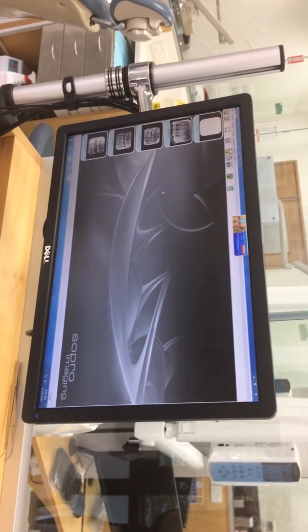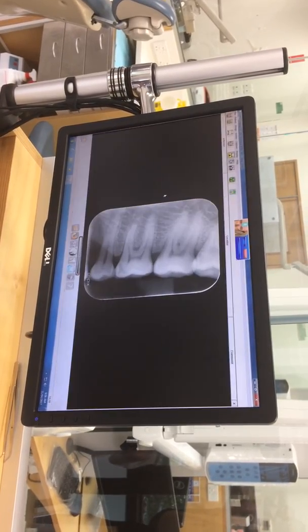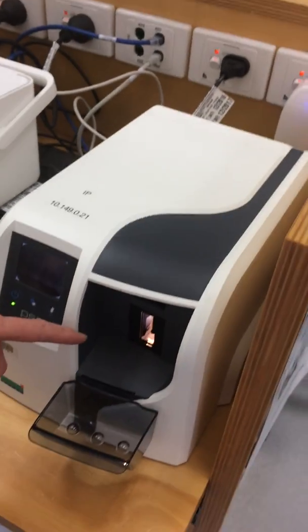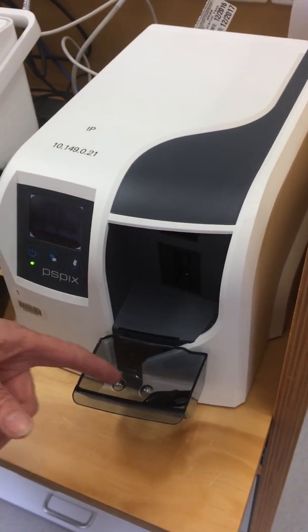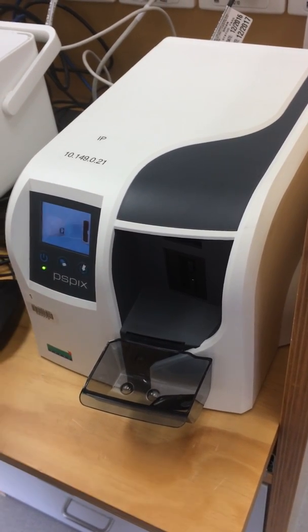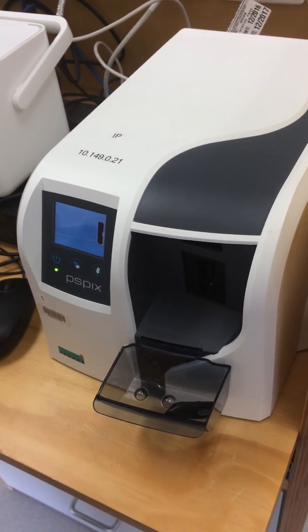Then wait for a short period of time — the image will be projected onto the screen. Then you look down here and your phosphor plate is returned to you. Your phosphor plate is now cleaned; there's no image on it, so it's actually ready to be processed again.